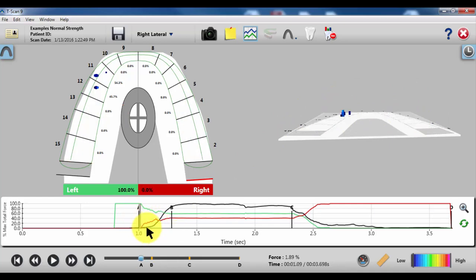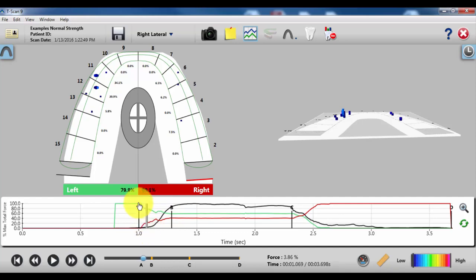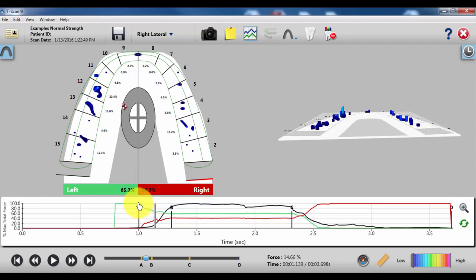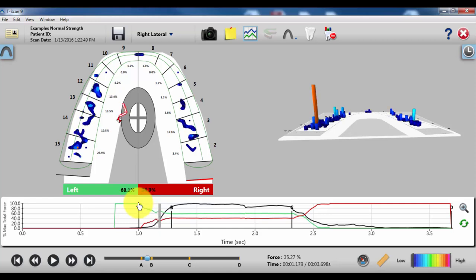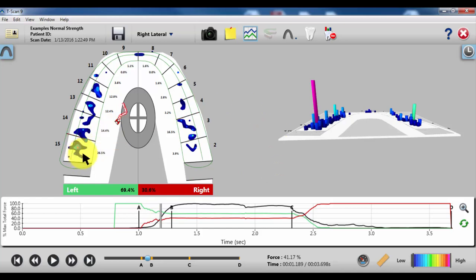So again, for balancing a bite, you're just looking for high forces. You start at the A, you right click through until you start to find some force discrepancies. The main one here looks like 15, and that's the one you would go mark and make your adjustment.